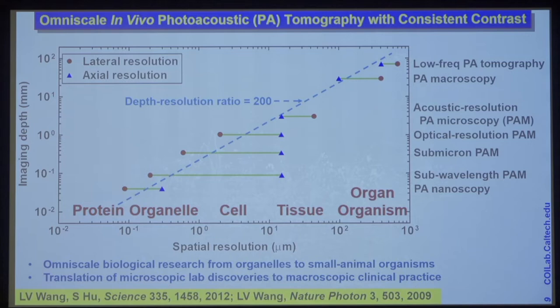You pick a depth, and then we can design the system accordingly to best match the preferred resolution and depth. And so each horizontal bar represents one of the implementations. There are many more implementations than I can plot here. I will go through some of them just to give you a flavor about the capability of the technology.